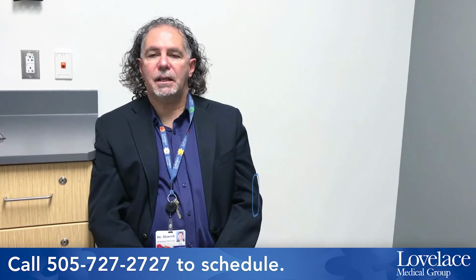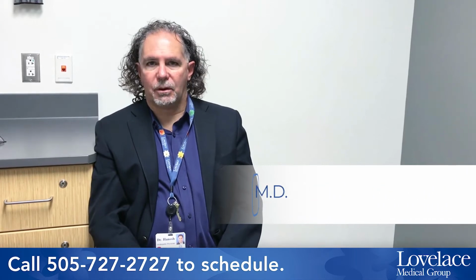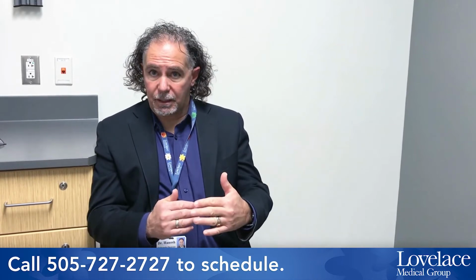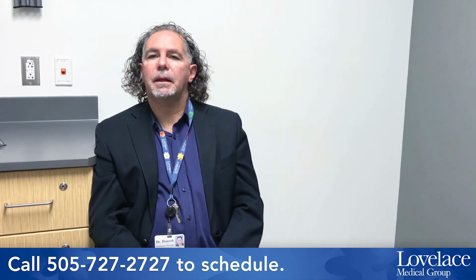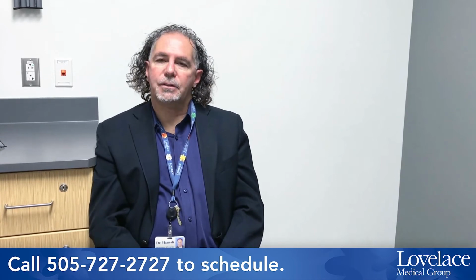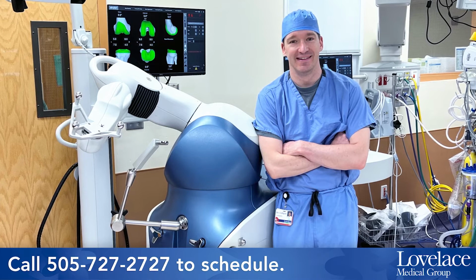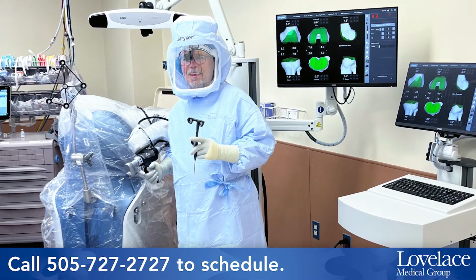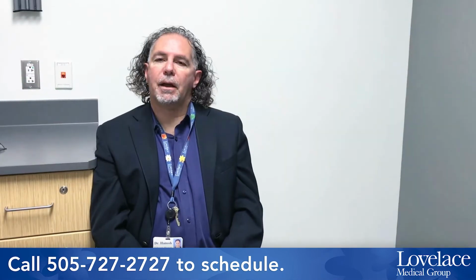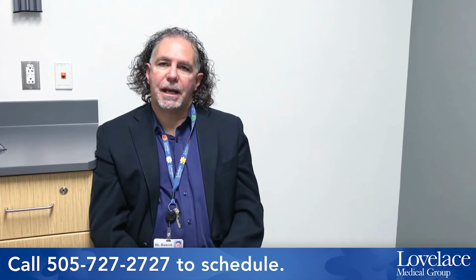With the MAKO technology, the concept really revolves around more precise surgical procedure. So in surgery with traditional instrumentation, we're asked to make bony cuts to get the limb alignment as close to perfect as possible. We have to make some accommodations for human error when it comes to making those cuts, so we shoot for the middle of the road, and people do very well with that. With the robot, we can dial in within 0.5 degree of what we'd like to do in terms of getting the cuts as close to perfect as possible and remove the human error part out of it. So as a surgeon, we still make all the decisions about how we would like the knee to feel at the end of surgery, but the robot helps us accomplish that more accurately.